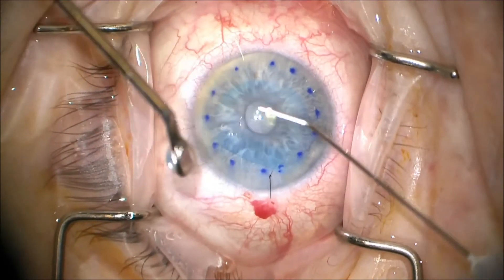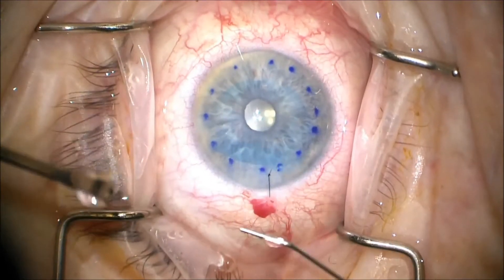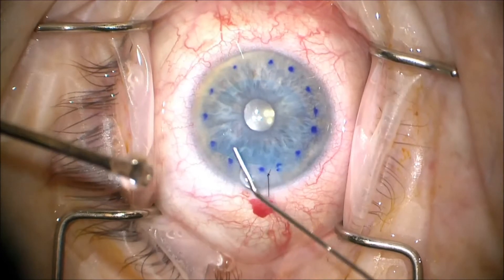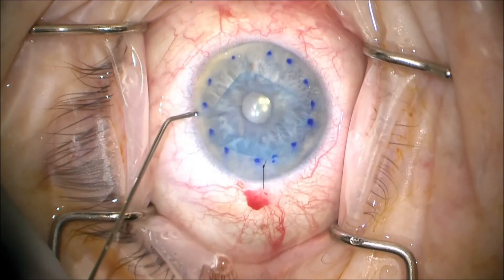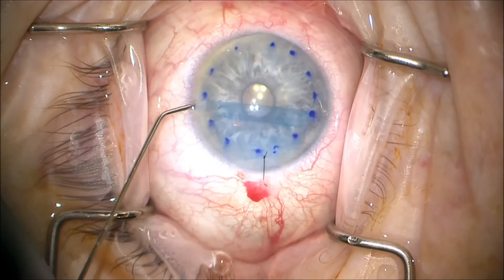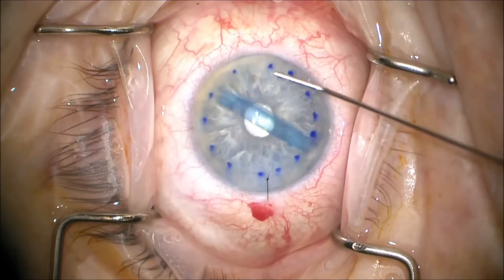Once we get to this point, we notice the S, which is at about 10 o'clock, and we notice that it's actually backwards — as you can see right there. So at that point we know that the graft is upside down. We have to deepen the chamber and allow the graft to scroll up on itself, as we can see there.